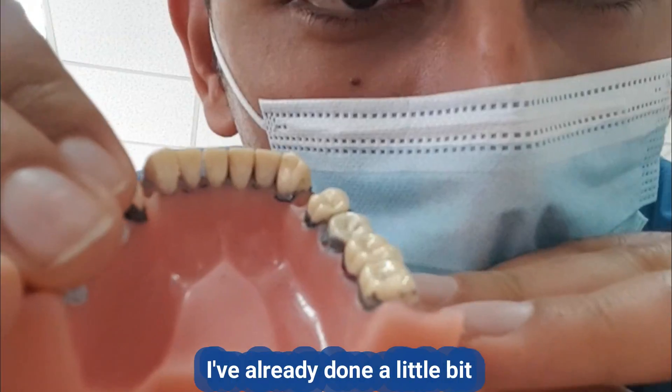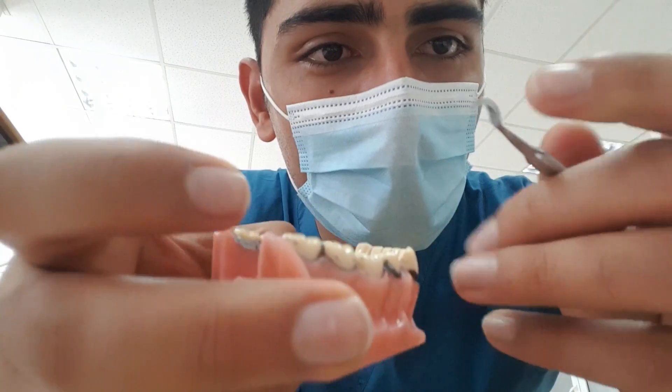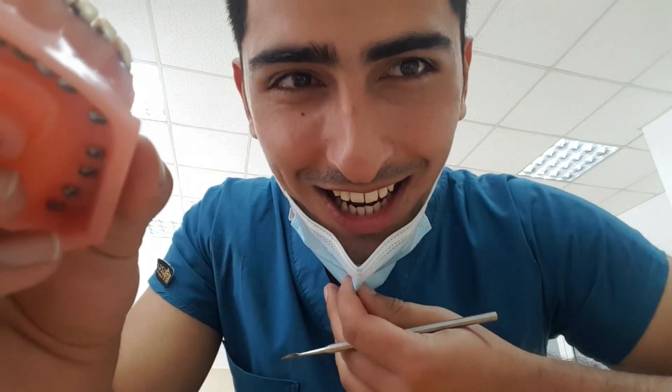I've already done a little bit as you can see. Here's my sickle scaler. I'm just using this right now to practice removing calculus from these plastic teeth, so when the real patient comes in, I'm going to be ready and we're going to do an amazing job. Let's go.